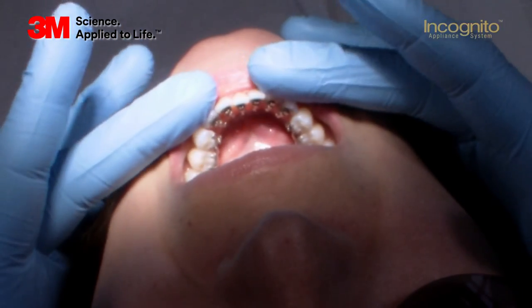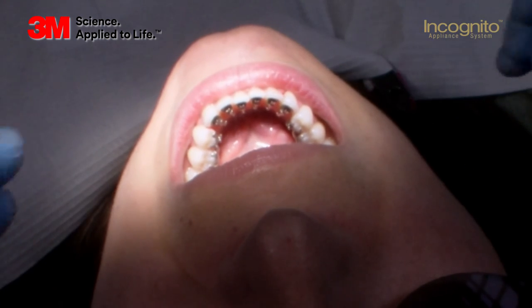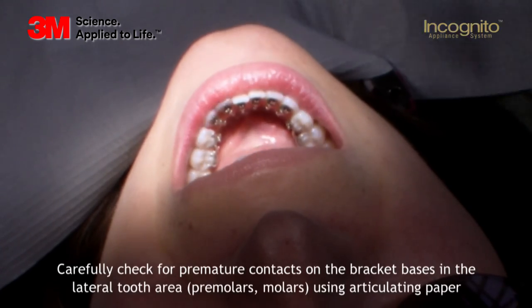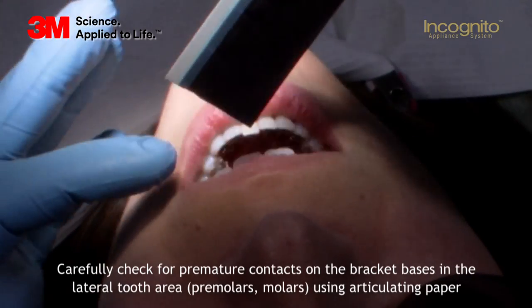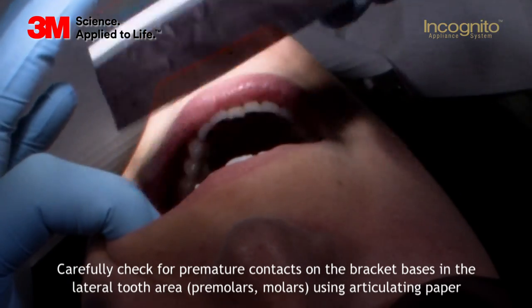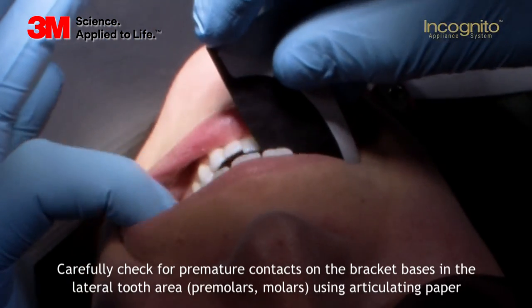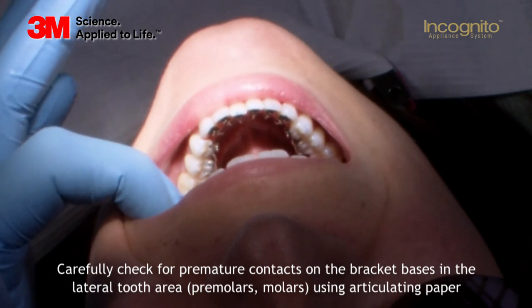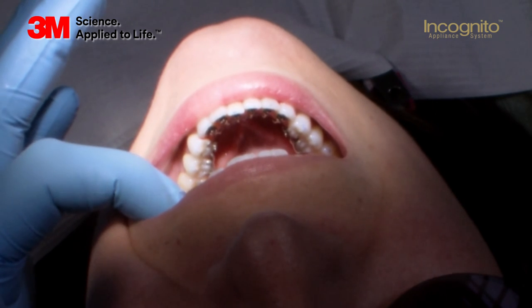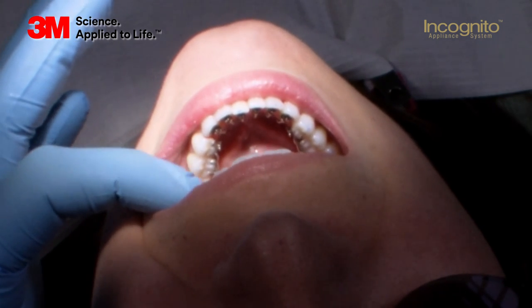A very crucial part of my treatment is now to check if we have any pre-contacts while biting together. Please ask your patient to bite together on the occlusion paper. As you can see now, what I also expect is no contact on the bracket itself.